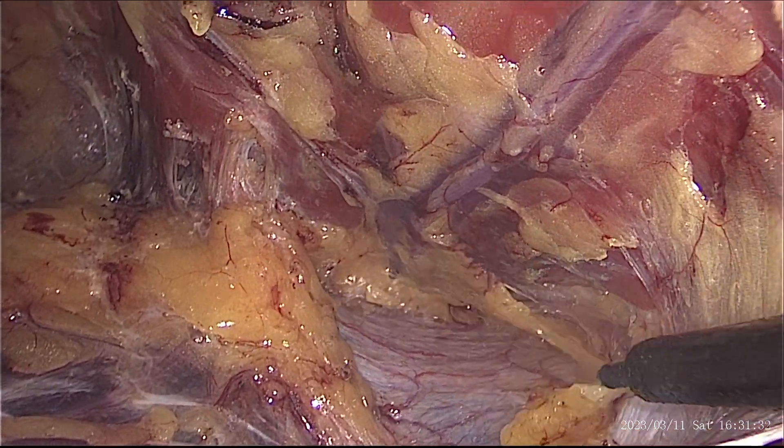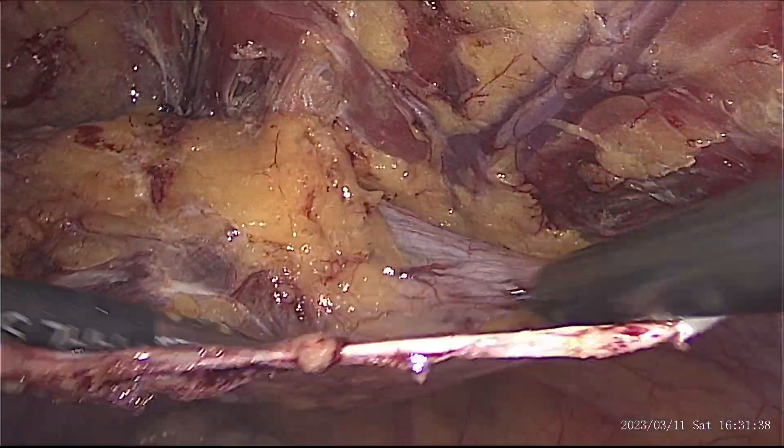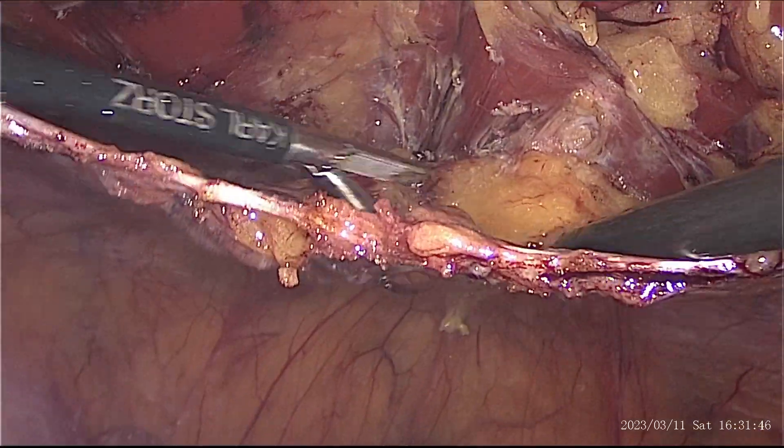Before proceeding to tackle the flap at the hernia defect, we have created adequate space on both sides of the defect. This helps us in keeping the peritoneal defect as small as possible.